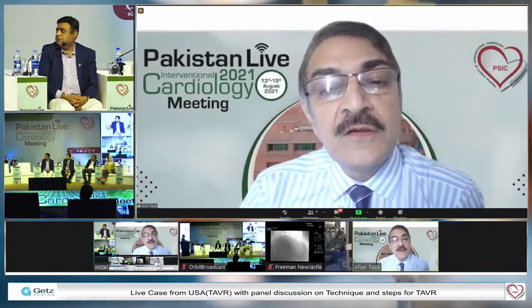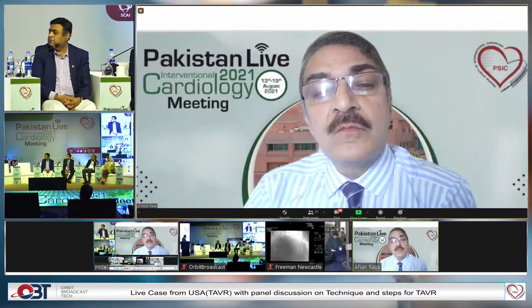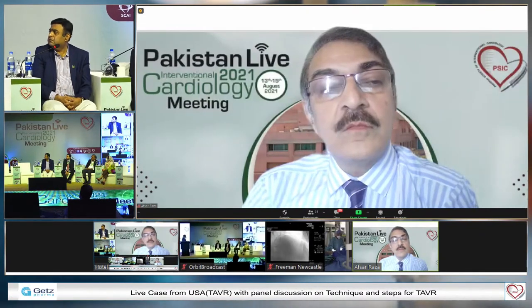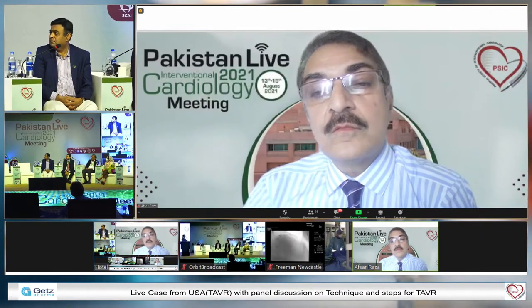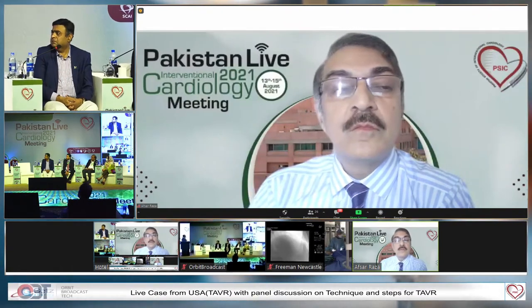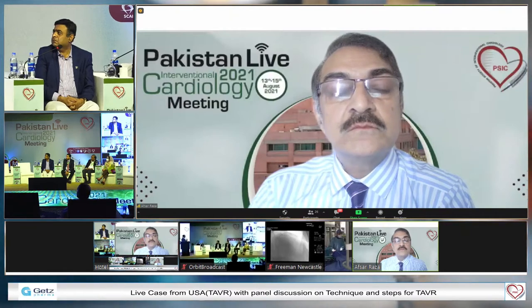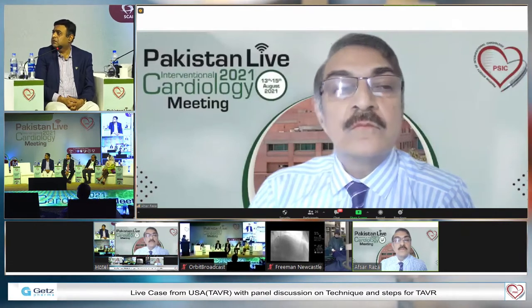And the best part, as Dr. Tahir Kelly said, is coronary access. We were the first commercial site for CoreValve in the US, Mount Sinai. So we did 60% CoreValves, and I was talking to Professor Noman the other day that he has done a few cases in the US where patients who had CoreValve came back in with a STEMI, and it's not very easy.